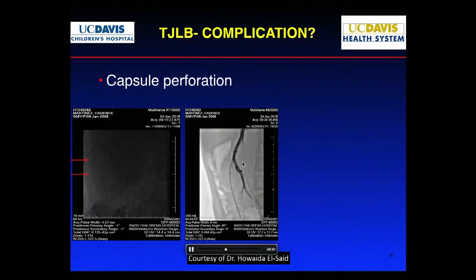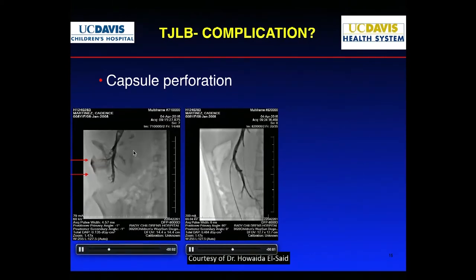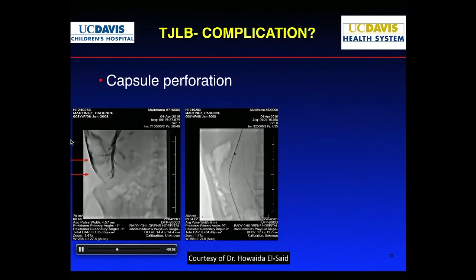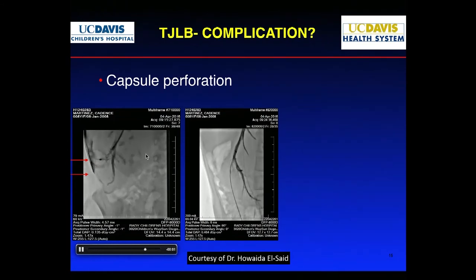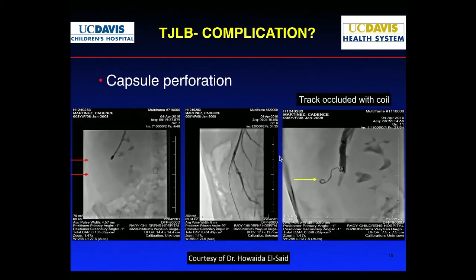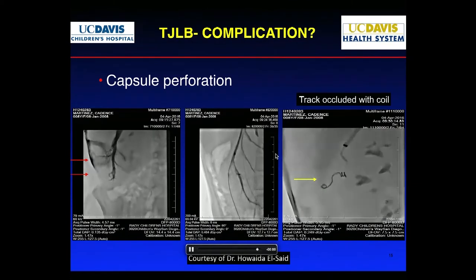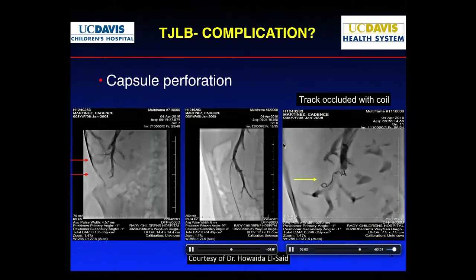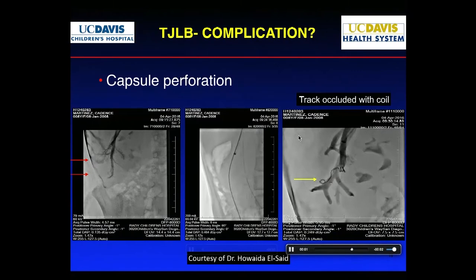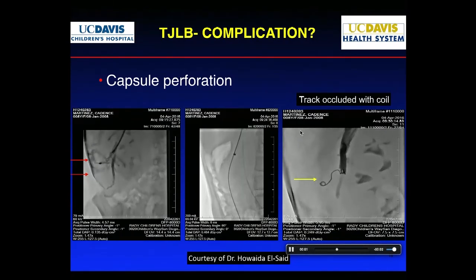Here's an example of when you rip through the capsule, right? So you see this perforation and bleeding into the retroperitoneal space. I borrowed this from one of my friends, Dr. Al-Sayed. But the nice thing is that just like when you do your transhepatic access coming from the other way, you can always throw a coil in and get yourself out of trouble there. So it's not a huge complication, but it always makes you worry, and you have to pay a lot of attention to it, because again, it's a 2-centimeter length needle that comes out. And so you have to be aware of what the length is.